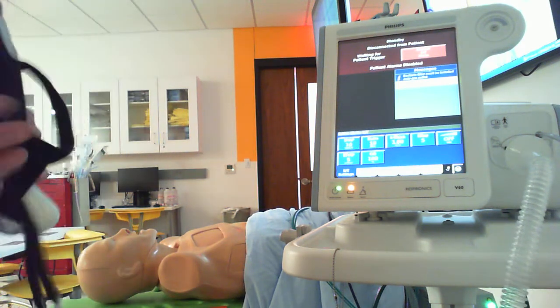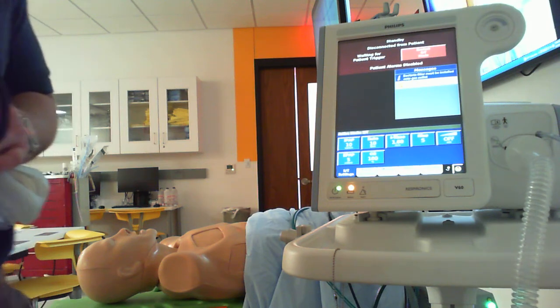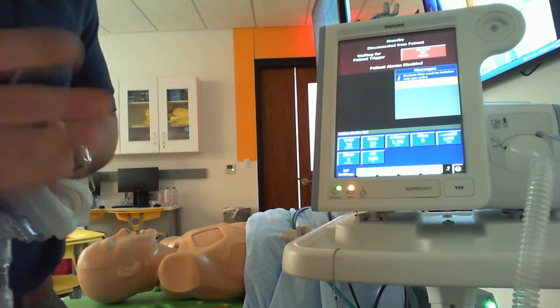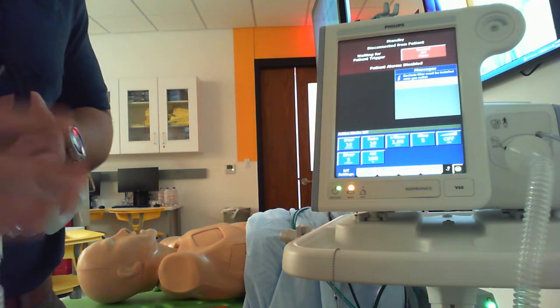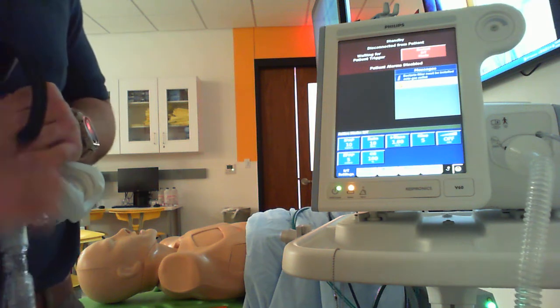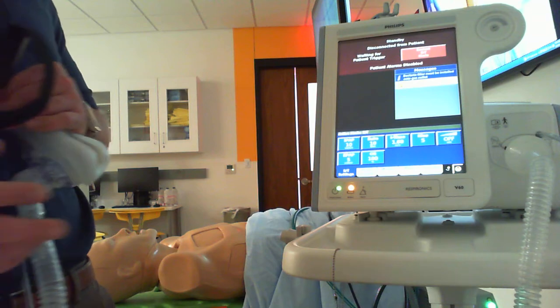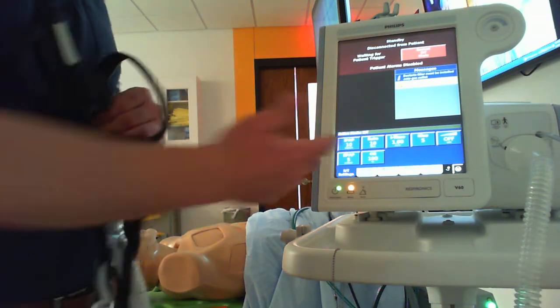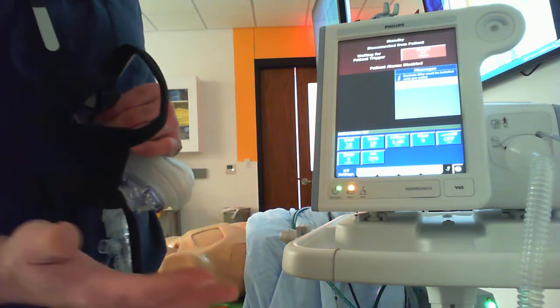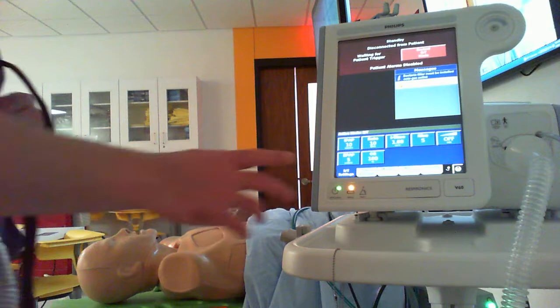You'll see a lot of people just start with 10 and 5 generically. 5 is typically okay for an expiratory pressure, 4 or 5. If you got somebody who's maybe got a little bit of auto PEEP, COPD exacerbation causing issues, a little bit of marginal oxygenation. When we have somebody with significant shunting and a significant oxygenation problem, or somebody with congestive heart failure exacerbation and terrible refractory hypoxemia, those would be situations in which I'd maybe want to start with a little higher elevated baseline, maybe at 8, 10, 12 centimeters of water, depending on what's going on.